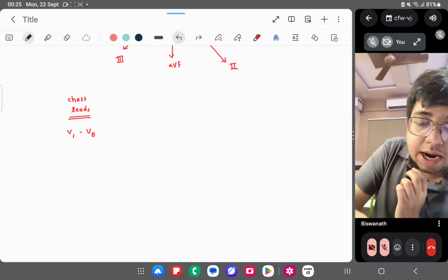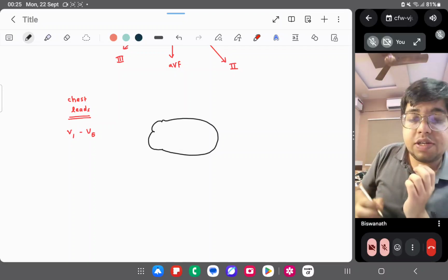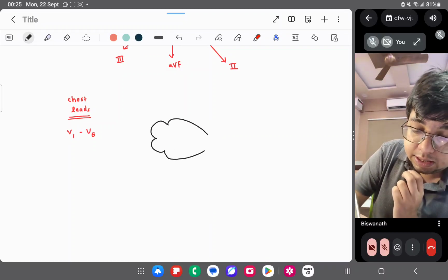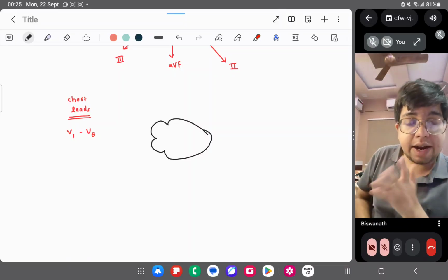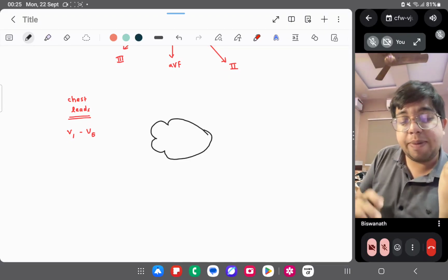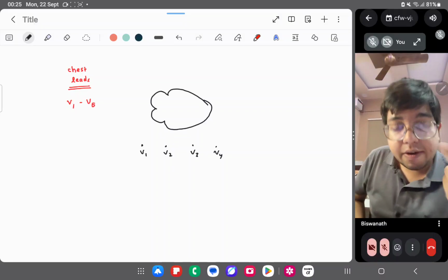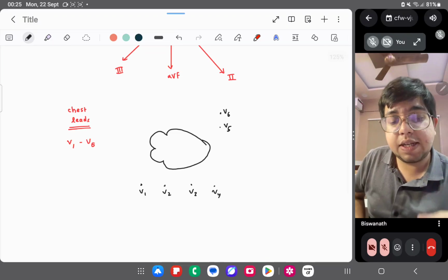So now I place the heart like this in the horizontal plane. Okay, this is not the heart, this is something else. So this is the heart. We don't really want that heart. So this leads V1 to V6, how we place them. Let us place V1, V2, V3, V4 in line, and V5 and V6 above it. This is the thing.